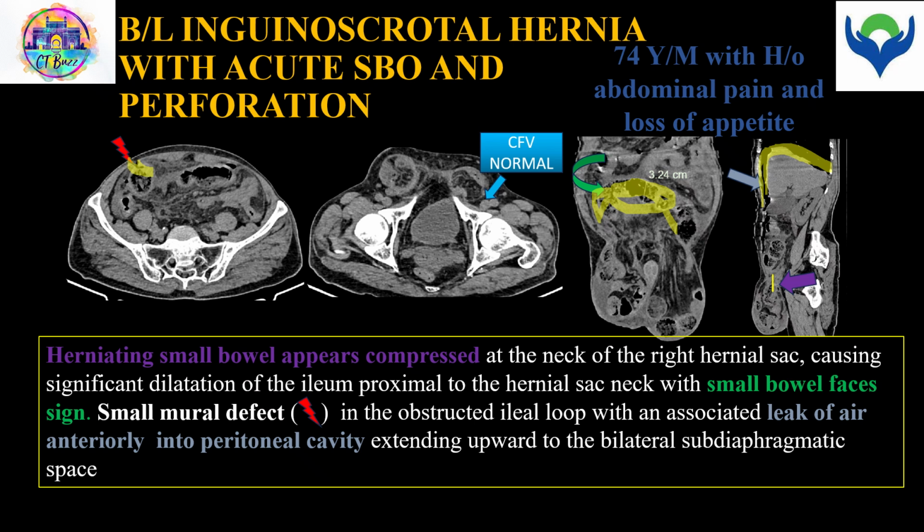Here we can see the common femoral vein is not compressed as this was an inguinal hernia.